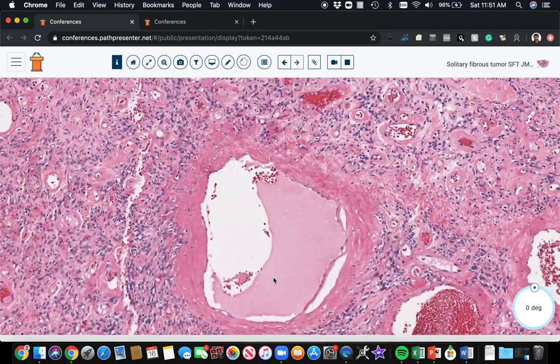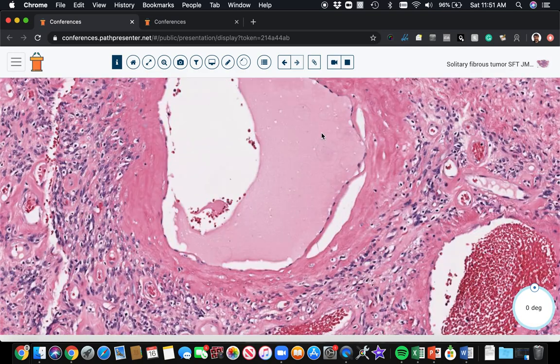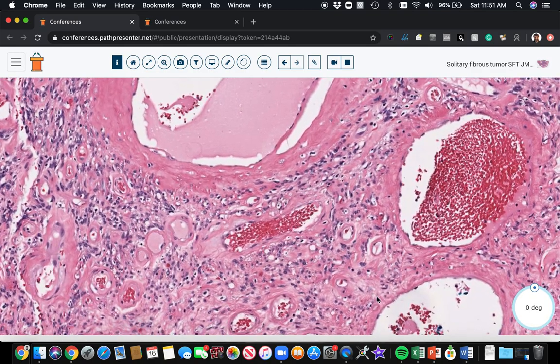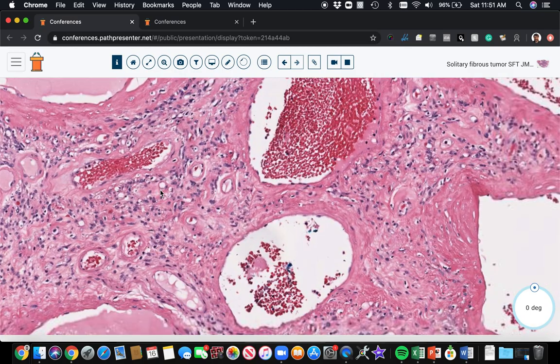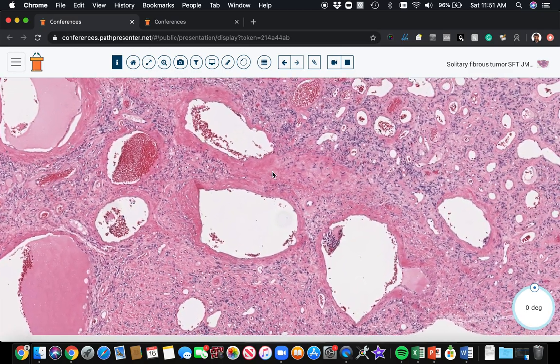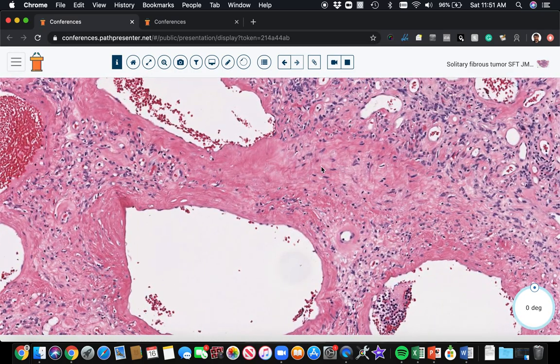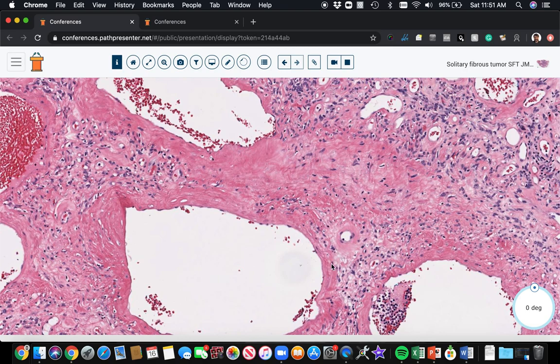The vessels often have thick sclerotic walls. There's often sclerosis and sometimes there are big zones of, like here, these big areas of hyalinization where there's very few cells right around the vessels. That's characteristic of solitary fibrous tumor.